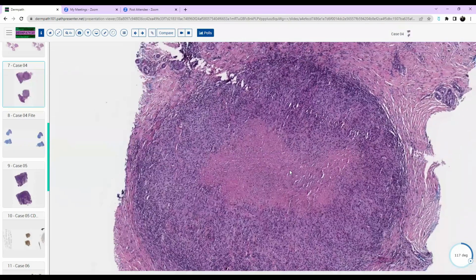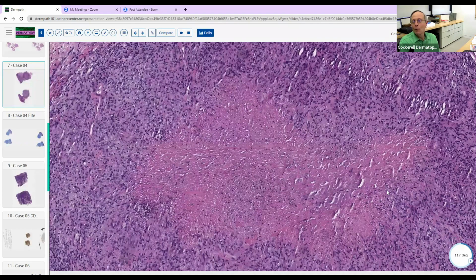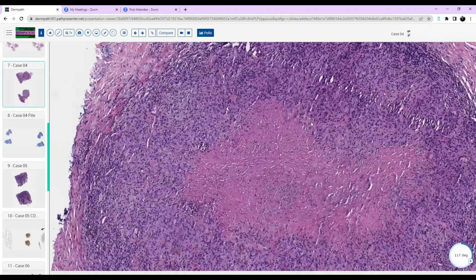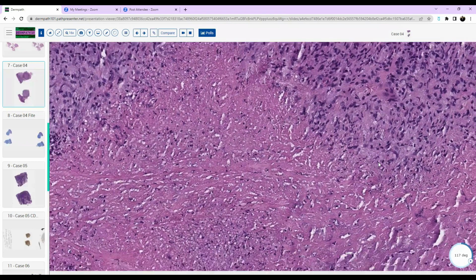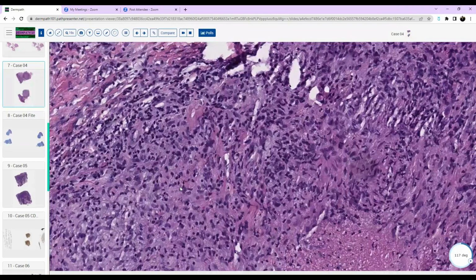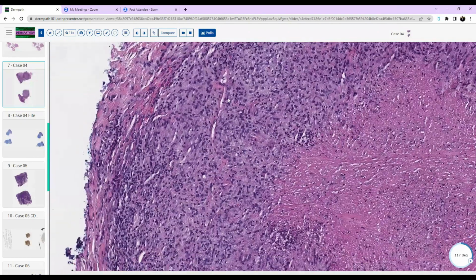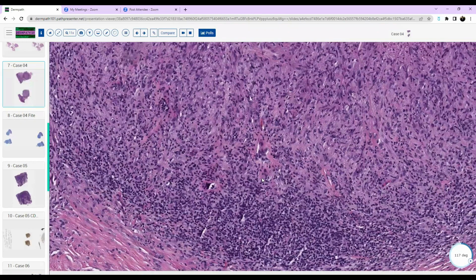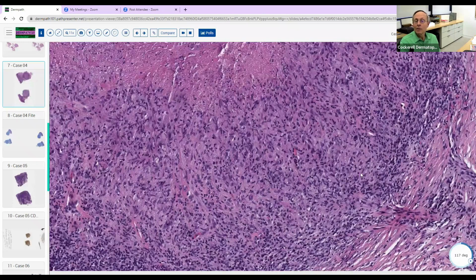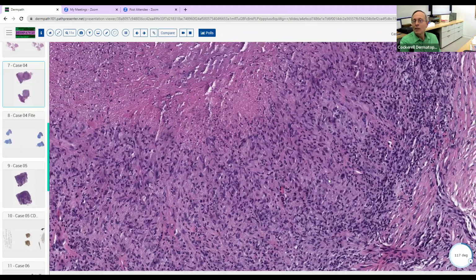If you want a good example of caseation degeneration to teach your medical student colleagues, this is a perfect example of it. Looking a little bit closer, there's lots of neutrophilic dust, so lots of neutrophils around the area. And then around it mostly lymphocytes, and you can tell it's pretty organized as a granuloma because there's a band of fibrocytes around there. So it's definitely working on walling it off. When you say organized, you mean that the host is trying to wall something off, build a fortress around this thing and get rid of it. I think that's what you're meaning.